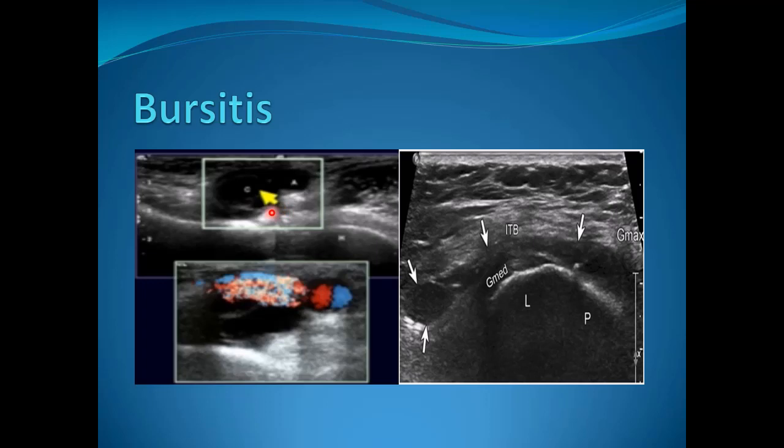This is an example of the region of the common femoral artery and vein with a cystic region surrounding them. By color Doppler, we can differentiate the vessels from the bursitis, which is located lateral to the vessels.